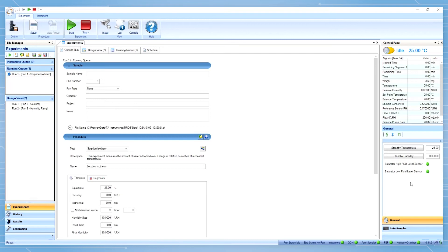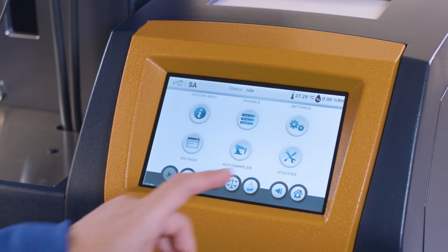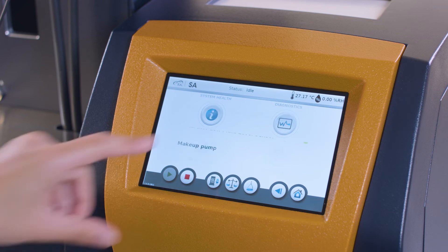You can check the saturated level under the TRIO control panel or the touchscreen. On the touchscreen, press utility from the home screen and then select water level. It will also show the makeup pump status.